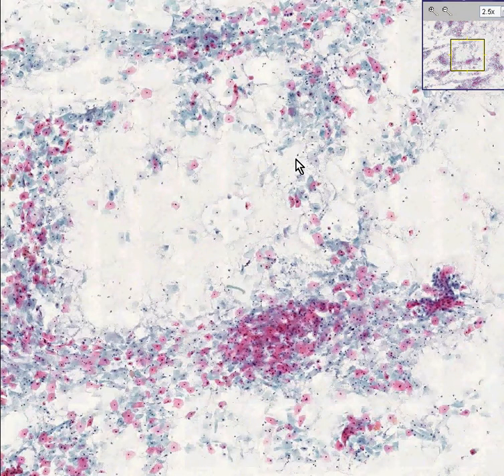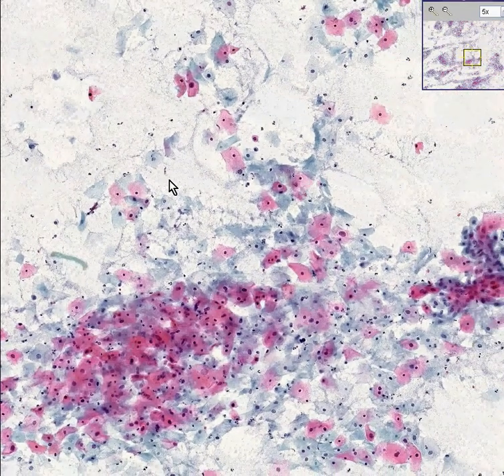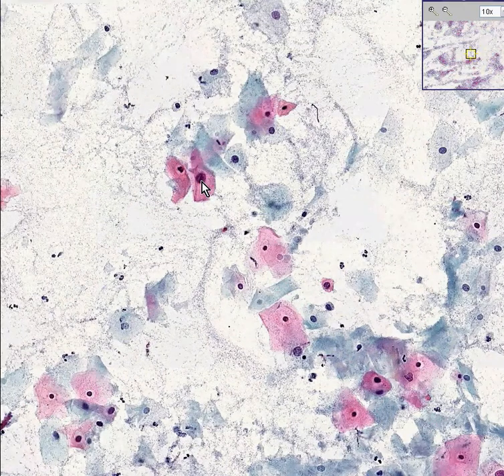It's called a Pap stain, named after the world's most famous pathologist who virtually cured cervix cancer, named George Papanicolaou. The theory behind cytology is to look at the cells individually and to see if there's any abnormalities. Now, we know the classic abnormalities of malignancy and pre-malignancy is that the nuclei get larger relative to the cytoplasm, or there's an increase in N/C ratio.